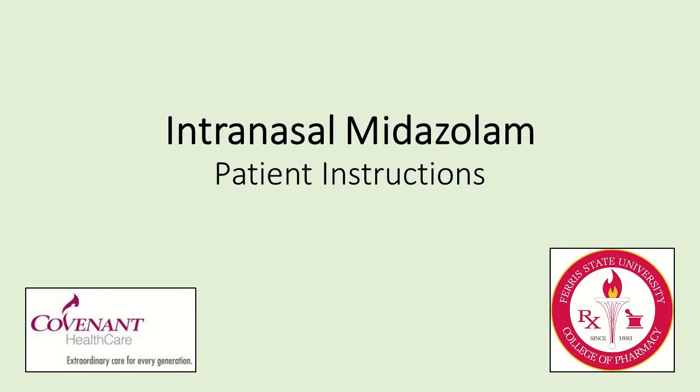The following information is a step-by-step guide for giving intranasal midazolam, or Versed, to a person who is having a seizure.